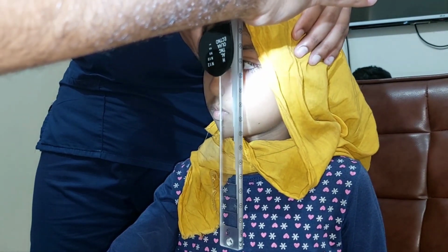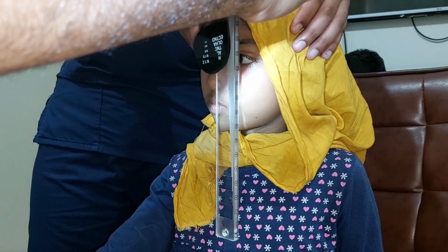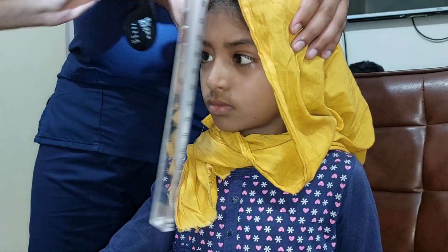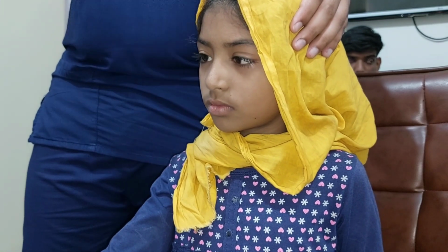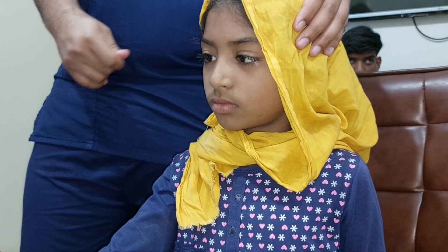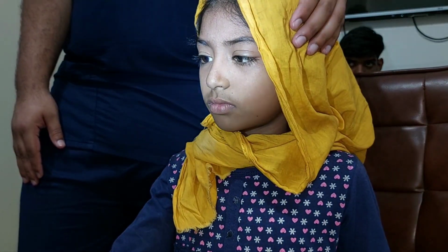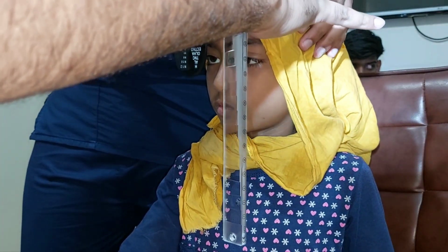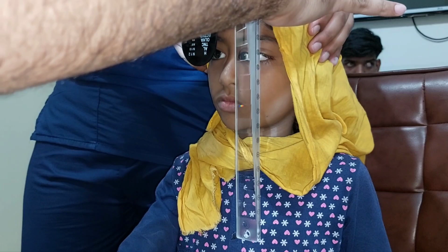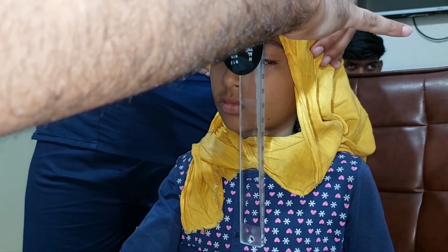Performing the alternate cover test. So keep the occluder for 2-3 seconds so that the eye takes up the fixation. When the eye is straight, then you change the occluder to the other eye, or shift the occluder to the other eye. So permit the eye to become straight and then alternate.